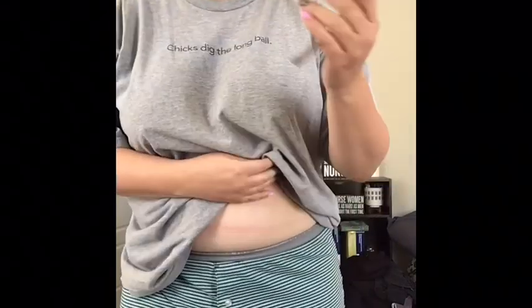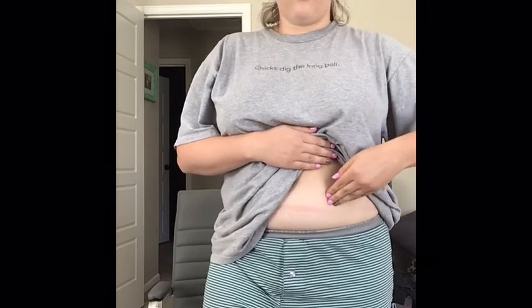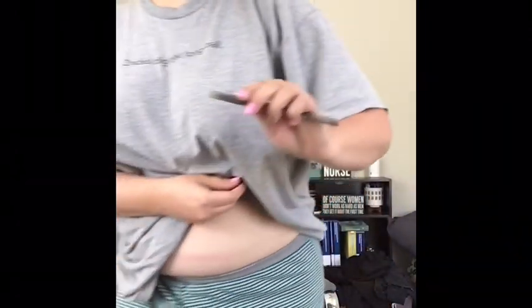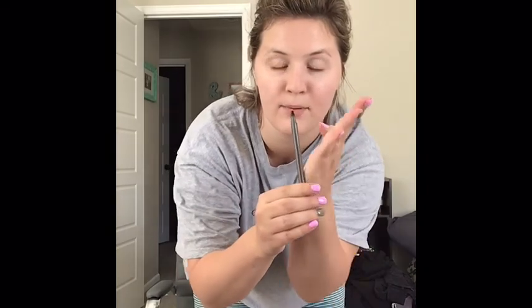Let's say I have an alcohol wipe in my hand. So I'm going to alcohol, off, in a circular kind of motion, so you're wicking away all of that, if that makes sense. Then, obviously I have uncapped my needle, so that's uncapped. I'm going to set that down. And then if my safety, so sometimes safeties are like this, I would push that back so that's not getting in my way.